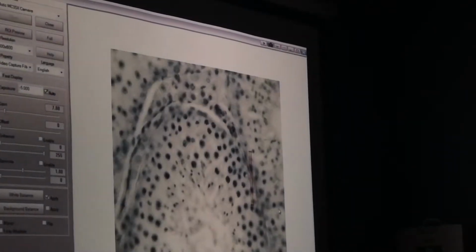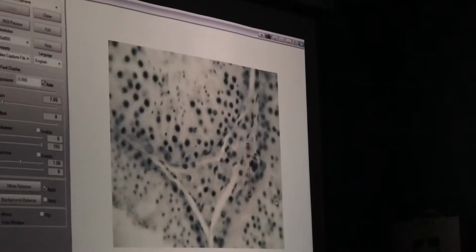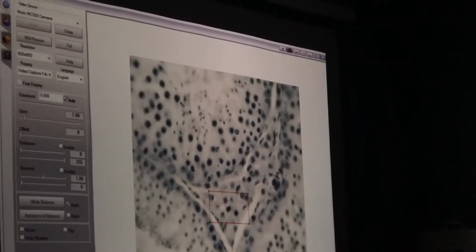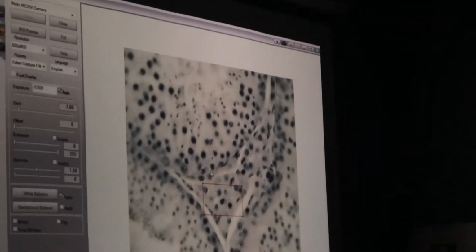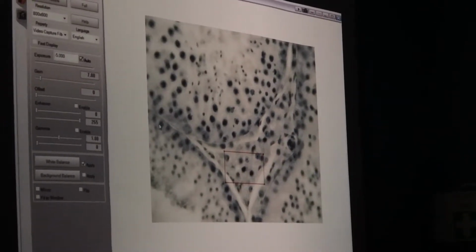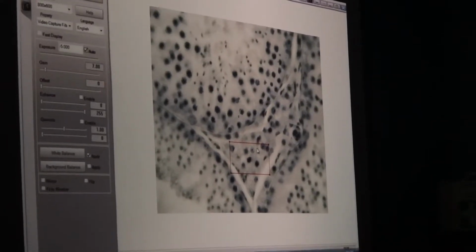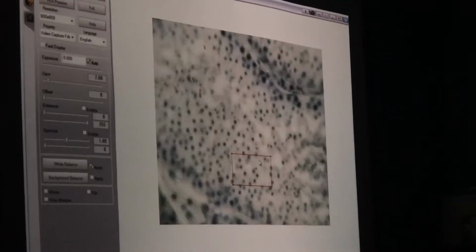Around the outside, we'll find some little cells that are kind of smooth, muscly-like. Anybody remember what those are called? No? These guys are going to be the interstitial cells, in between the seminiferous tubules, sorry. What were the cells that are around these called? Myoid cells, remember those? I don't think they're in your lab manual, but. Okay, interstitial cells are here in between the seminiferous tubules. What did they make? Testosterone.